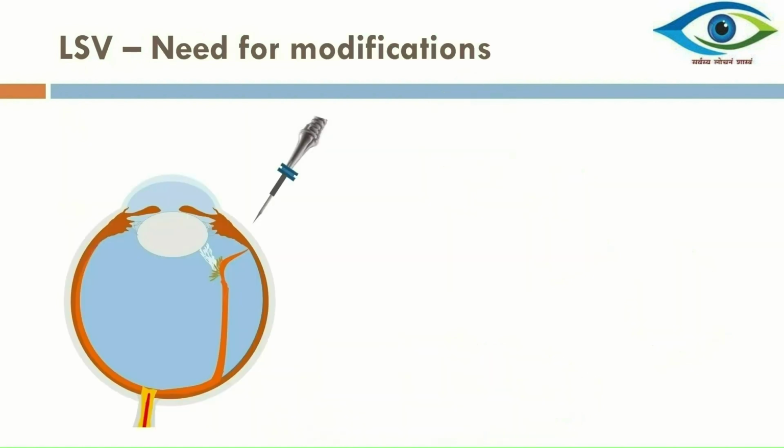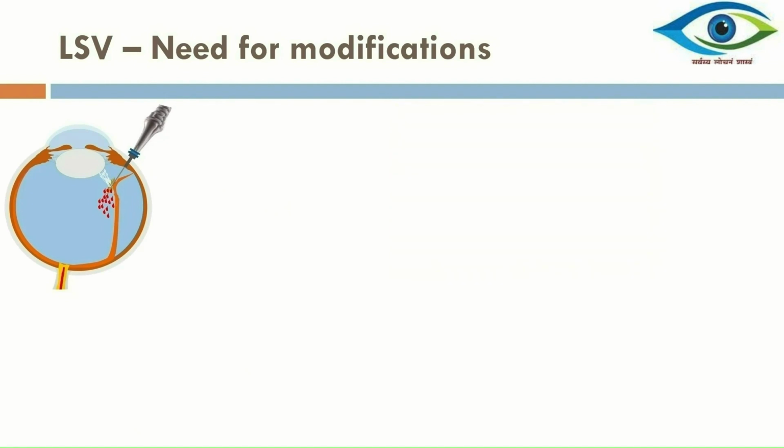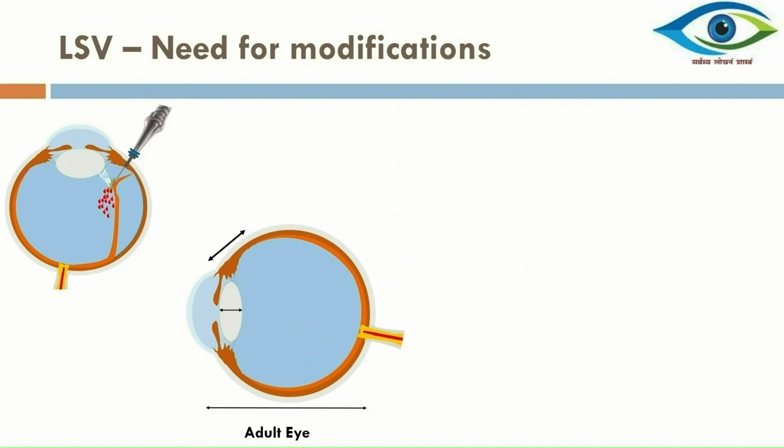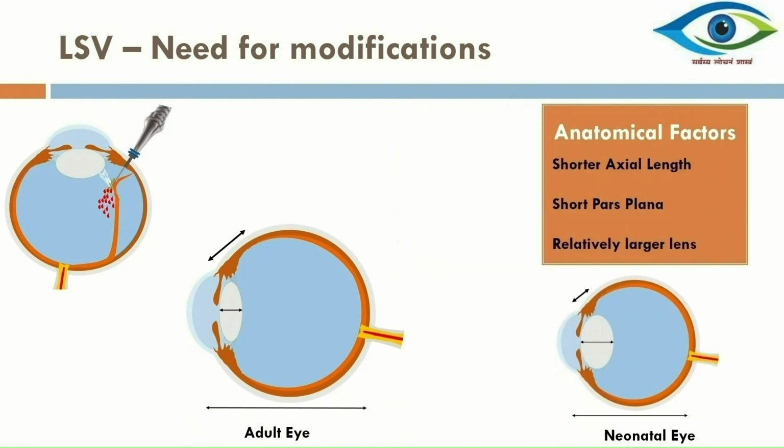Lens-sparing vitrectomy for ROP needs modification in various steps of conventional vitrectomy compared to the same in the adult eye due to the high risk of inadvertent injury to the lens or retina. We need to understand various factors which increase the risk for such injuries, including anatomical factors, instrument-related factors and disease-related factors. First of all, the anatomy of the infant eye is significantly different from the adult eye, with shorter axial length, relatively large globular lens, and short pars plana.